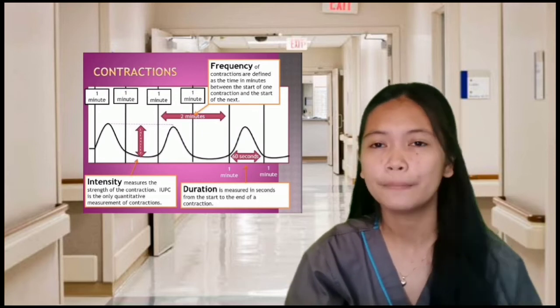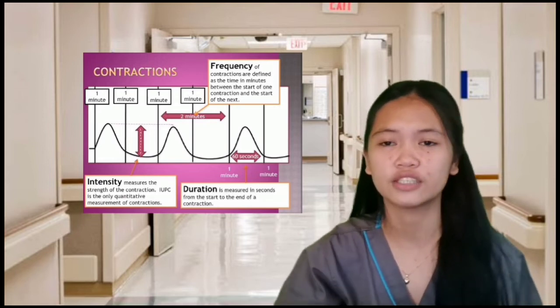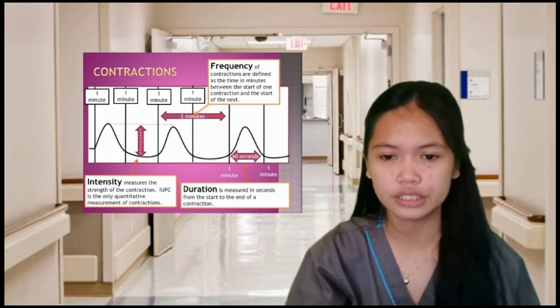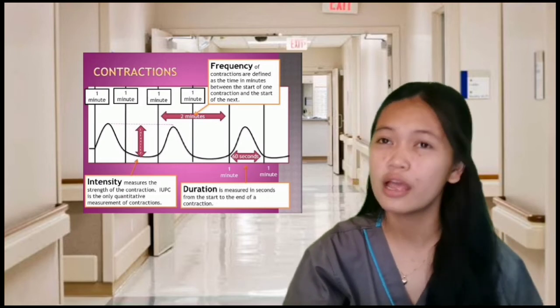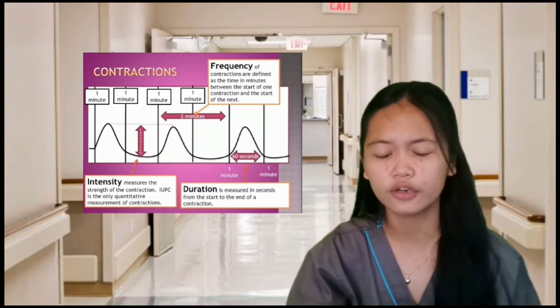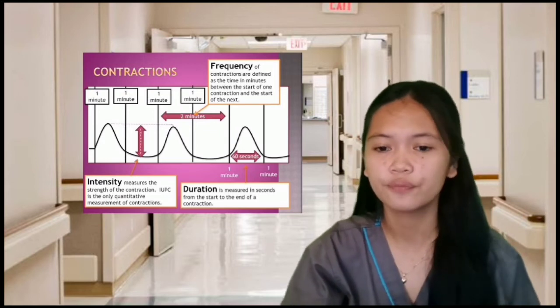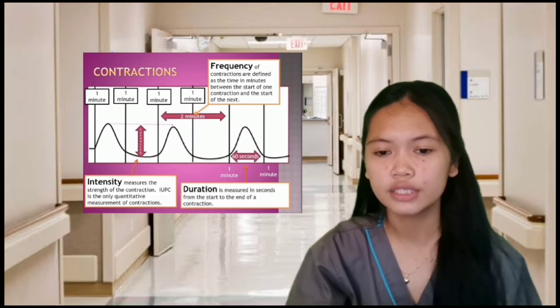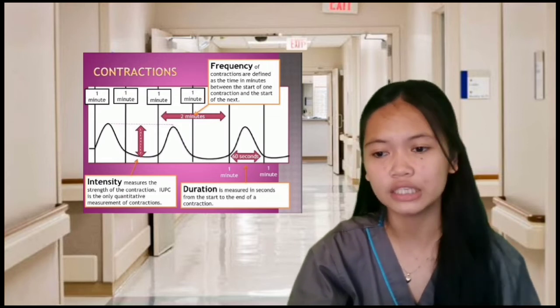It is a device placed inside a pregnant woman's uterus to monitor uterine contractions during labor. We will look at a 10-minute window of contractions. For each contraction, subtract the nadir, which is the lowest point of the baseline pressure, from the peak of the contraction. Add up these values, which represent contraction strength, measured in MVUs, or Montevideo units. 200 Montevideo units or greater is considered an adequate contraction pattern that should, in theory, be enough to promote cervical change.